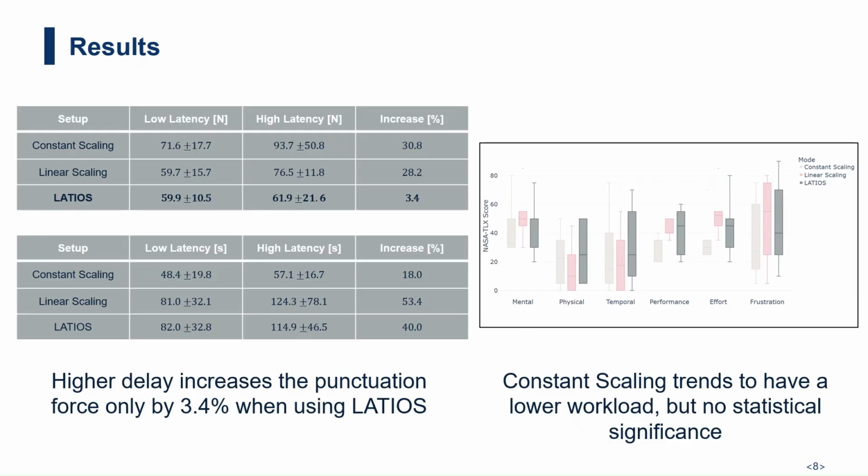Looking on the left side, you can see how higher delay barely increases the puncture force for LATIOS only, with negative effects on the task completion time. On the right side, you can see the data for the NASA TLX with trends but no statistical significance.